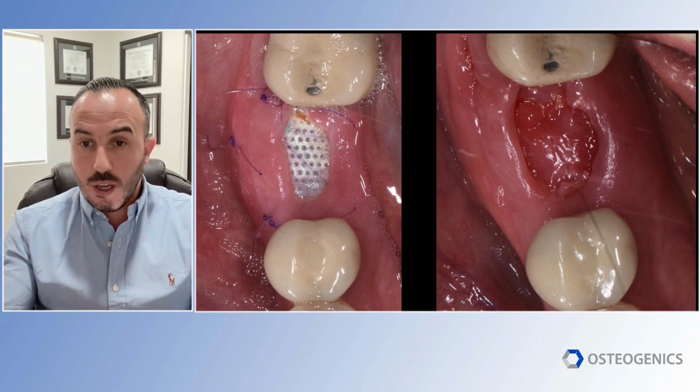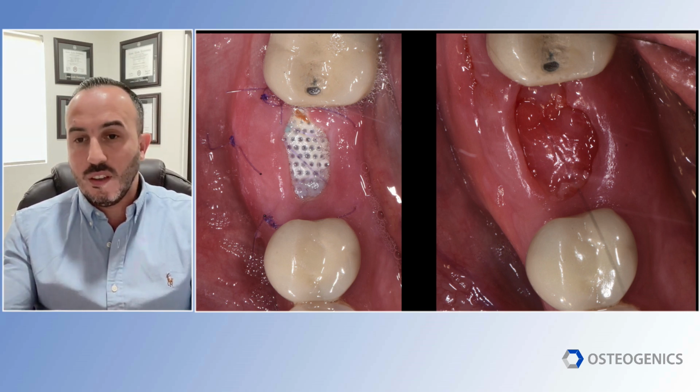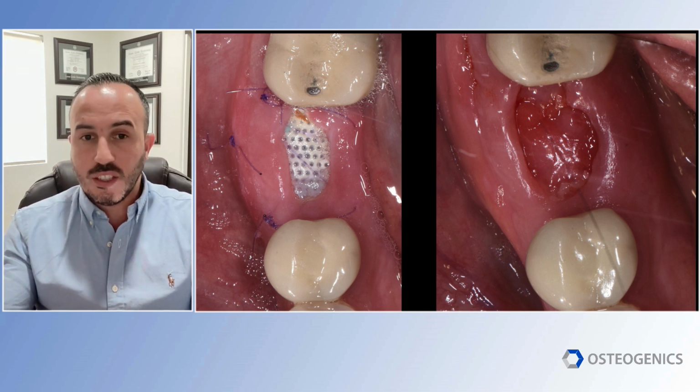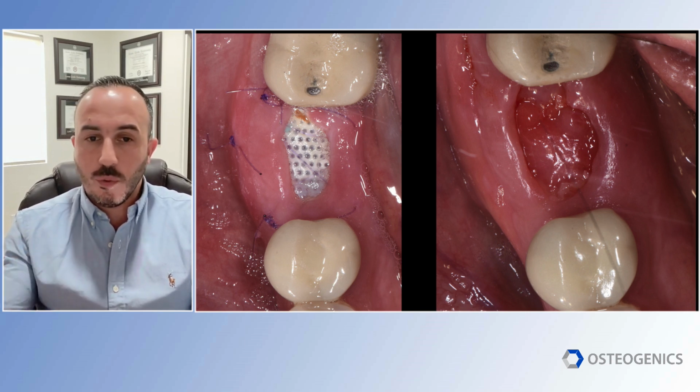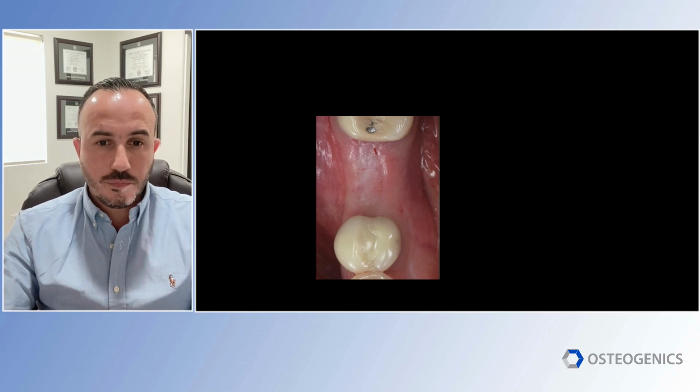But do we see it all the time? Not necessarily. Sometimes you may see some bony particles still stuck on top of that dense connective tissue. It's not a problem. You can rinse it with saline. Nothing to be concerned about. But this is what we typically see, and I'll show you in the other cases.